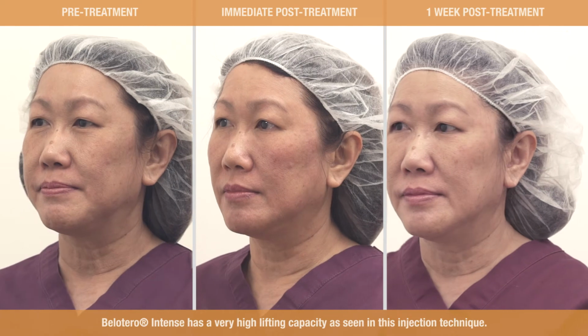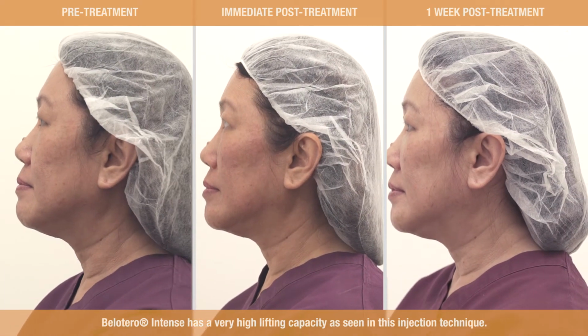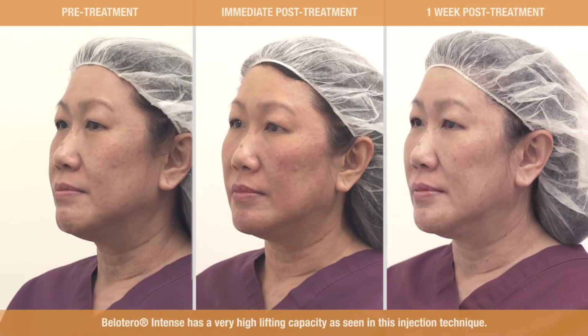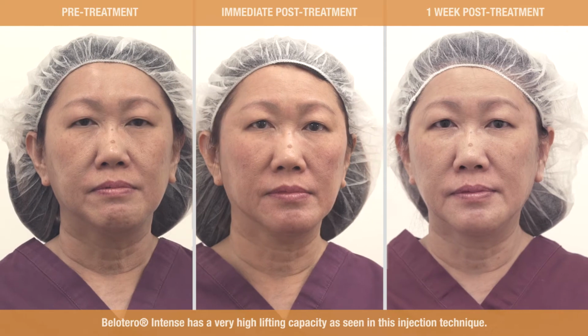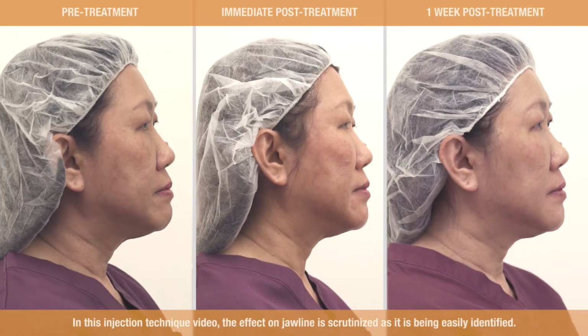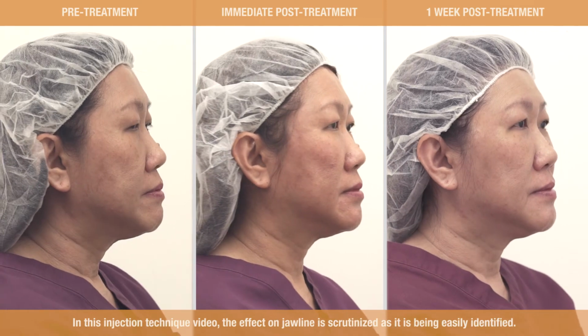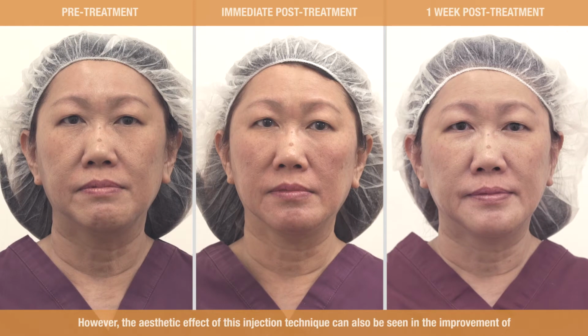This is the before picture and the 1-week post-injection picture after the initial swelling has subsided. The 1 grade improvement on the MERS jowl scale demonstrates the high lifting capacity of Belotero Intense. For this demonstration, we looked only at the effects on the jowls, as lifting on this area is easy to objectively quantify. However, as you can see, improvements can also be seen in the infraorbital hollows, nasolabial folds, marionette lines, as well as cheek volume.